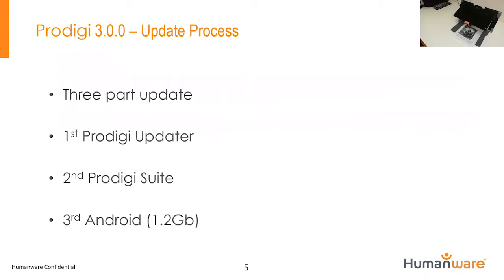And it's very important also to do that update because we have a new autofocus algorithm in it. So it helps a lot on the autofocus mechanism on the tablet. For all these updates, you will need the device connected to Wi-Fi.